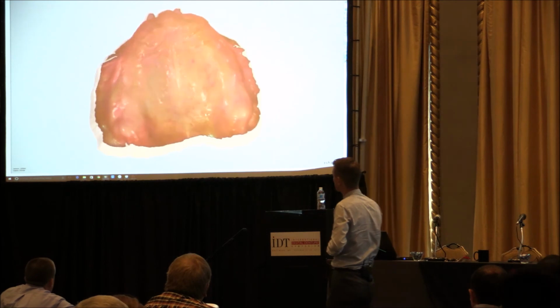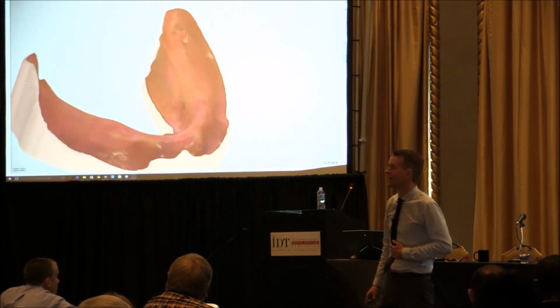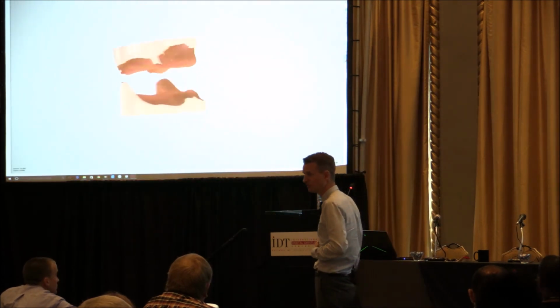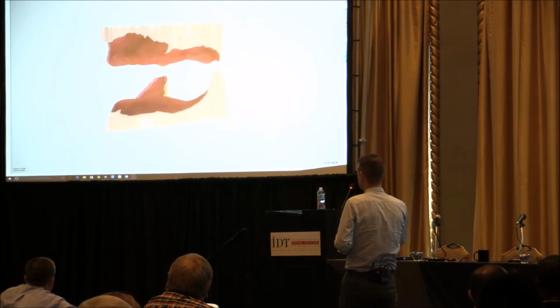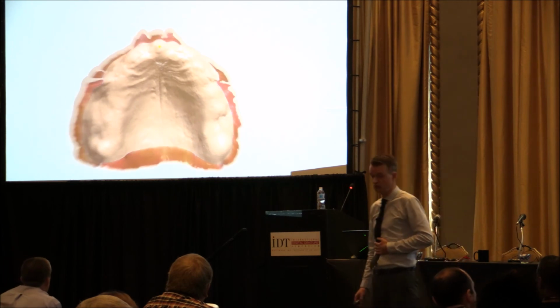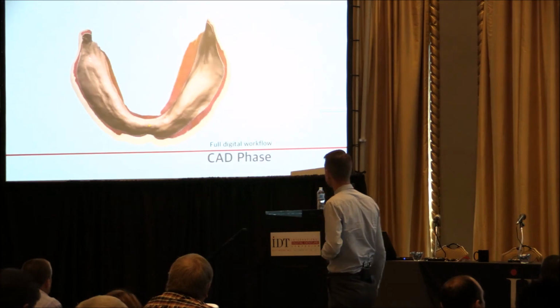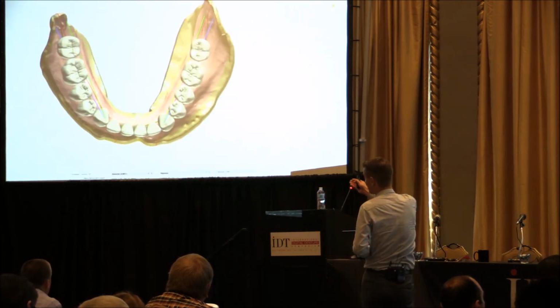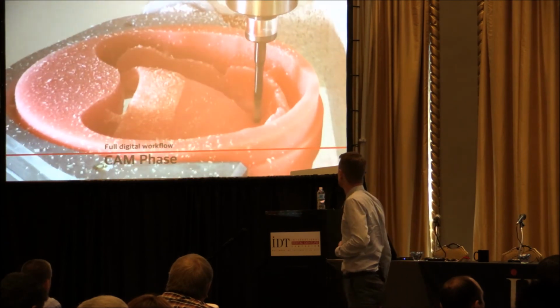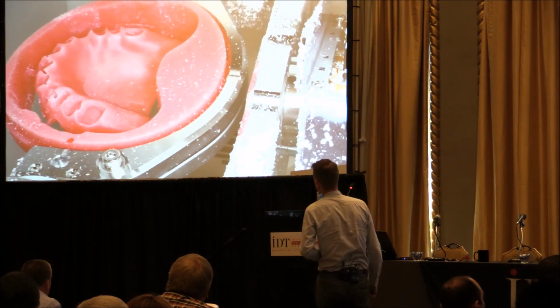All right, intraoral scans for dentures. Besides the two presenters yesterday, I have talked to three guys in the last two weeks who are doing dentures based on intraoral scans. You see a case here from an Italian partner we have, who has done 100 cases intraorally. So you see the design, how it goes. Again, there's no difference when you get in here whether it's an intraoral scan or a gypsum model. So he's milling and gluing in teeth, which is also great. Again, it's a working workflow.